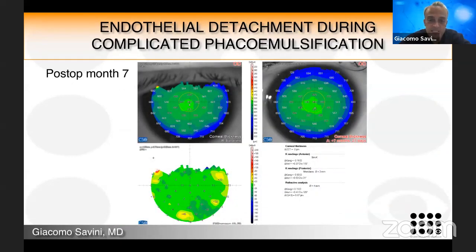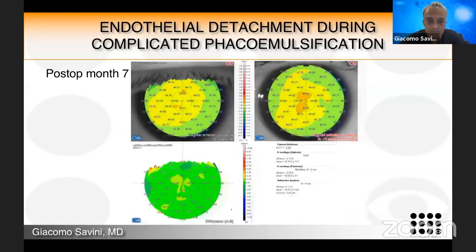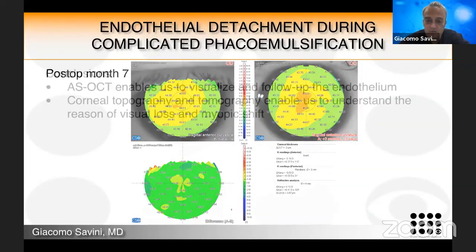And here you can see that if we compare the preoperative map on the left and the postoperative map on the right, they are almost the same. The CCT before and after surgery is okay. You see here also a nice feature of the latest Phoenix software, where the number of months is shown in the comparative, in the differential map. The same for curvature, with very little difference.